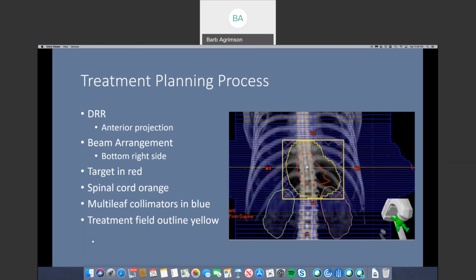So once again, the MLC leaves are spaced beyond what's contoured in as the tumor. Notice now that there are kidneys outlined also in this image. The MLCs help to block out most of those kidneys, which thereby minimizes the radiation dose that they receive.